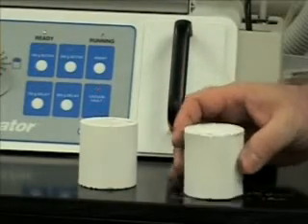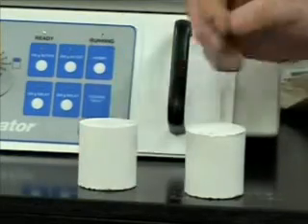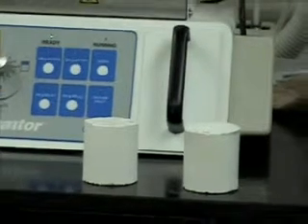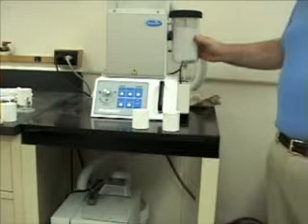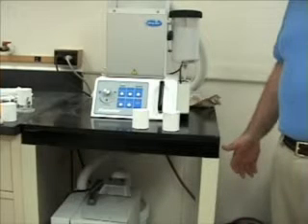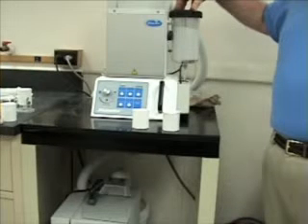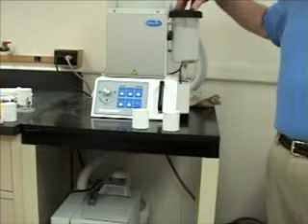Okay. Both of these types of artifacts indicate intermittent bead flow, and the primary cause of intermittent bead flow is moisture in the beads themselves, causing them to adhere to each other and coagulate, if you will, inside the unit. As we mentioned before, the humidity comes in either through the beads themselves as they are introduced into the jar. If they're brought in on the beads themselves, that can be handled by keeping the hot rock in the bead bucket, making sure it's plugged in at all times and properly submerged in the bead bucket.